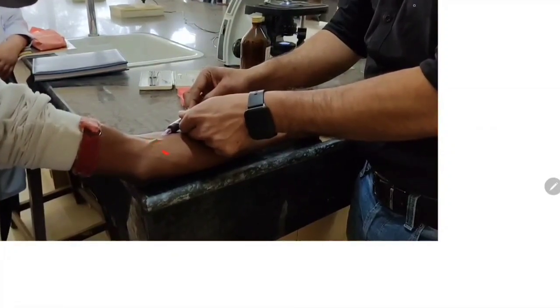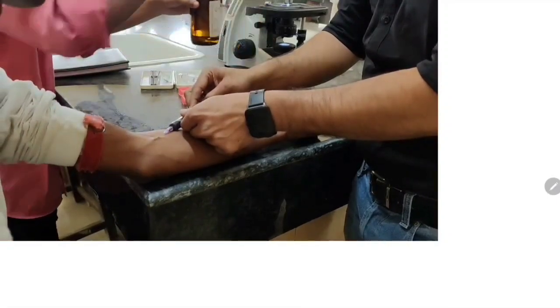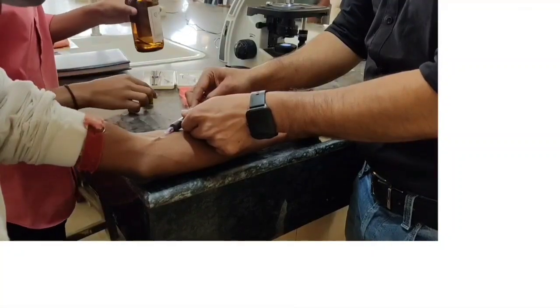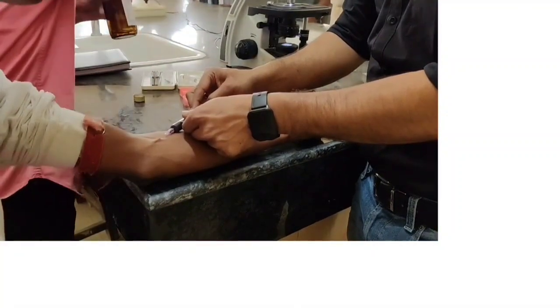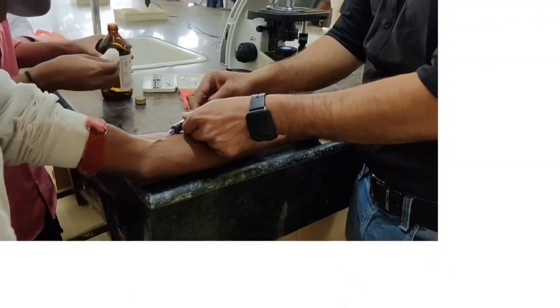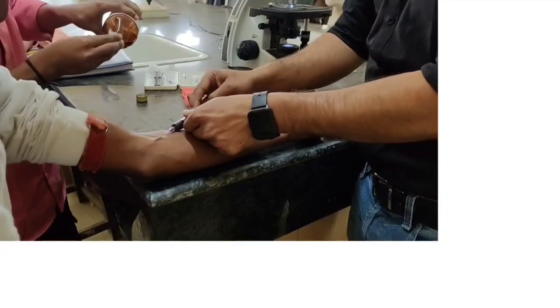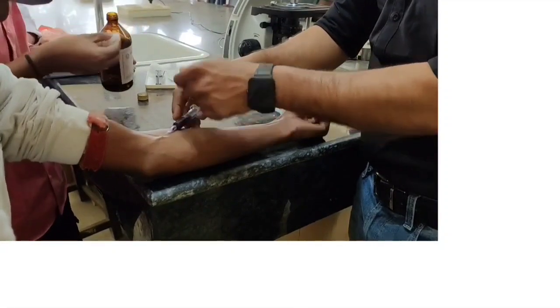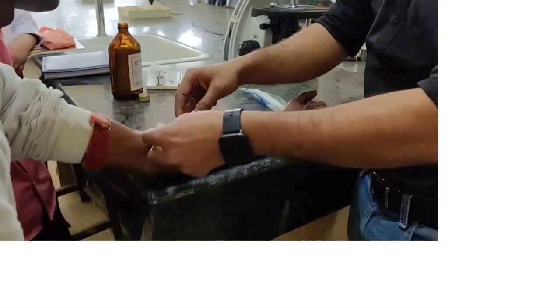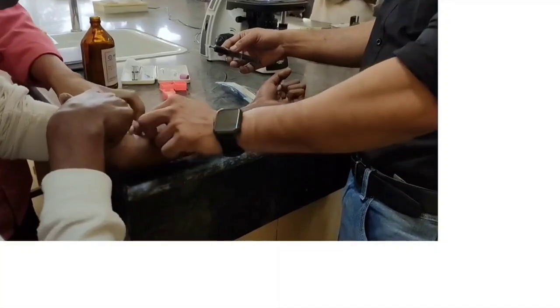Because it's easier to get blood from the prominent vein. Now it's done. So spirit swab we are going to use. Yes, so done. We have collected the blood sample.